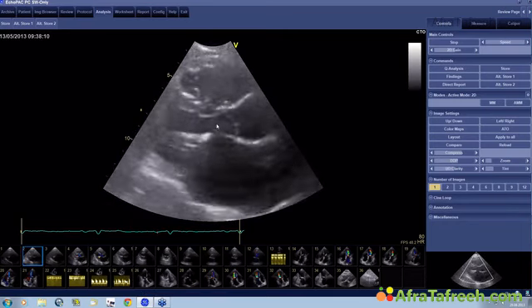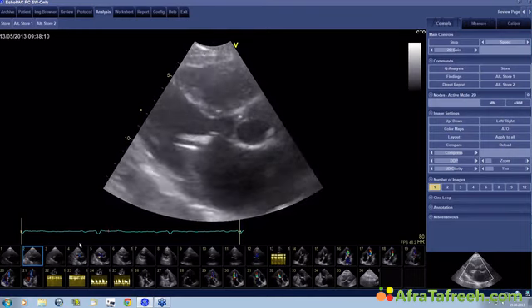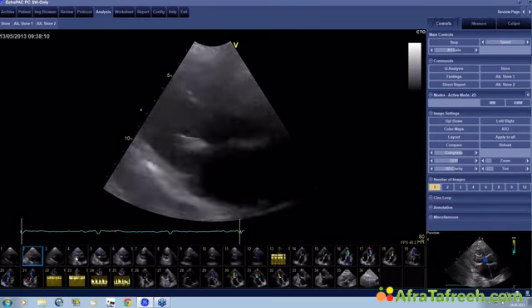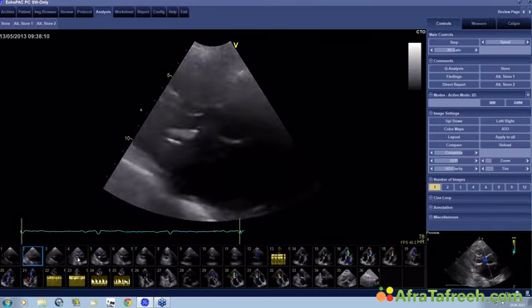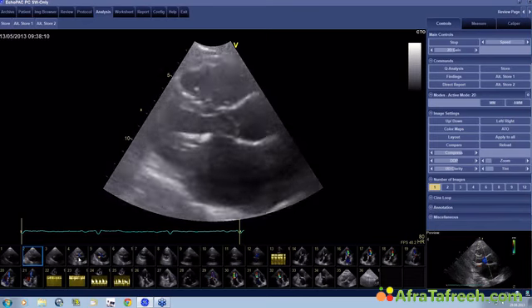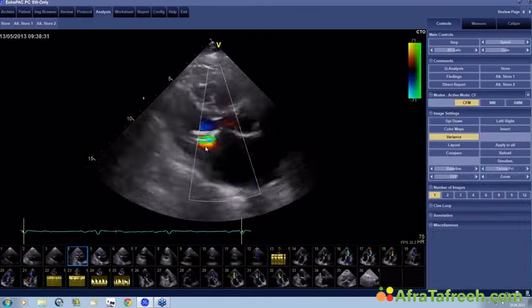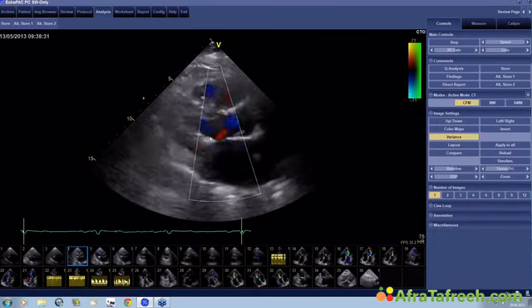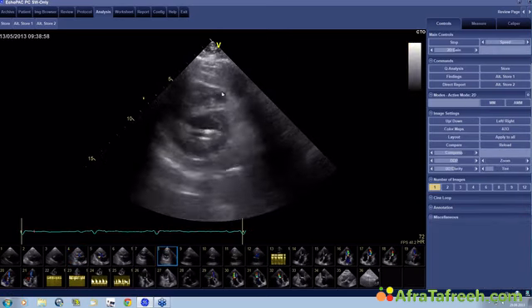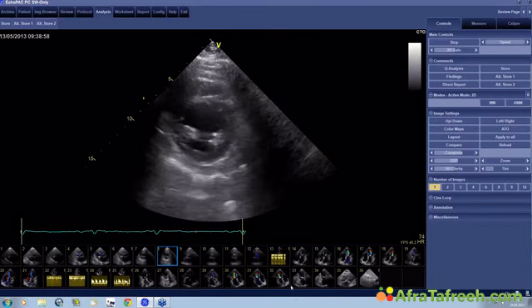Even though the image quality is not terrific in this case, I think you will all appreciate that there is doming of the mitral valve. So the diagnosis is quite clear. The only question is where it is, and how strongly the valve is affected by rheumatic disease. Okay, so here is the color flow, which shows you that there's turbulent flow through the mitral valve, and then you can go to the short axis view. You see a bit of thickening of the subvalvular apparatus.